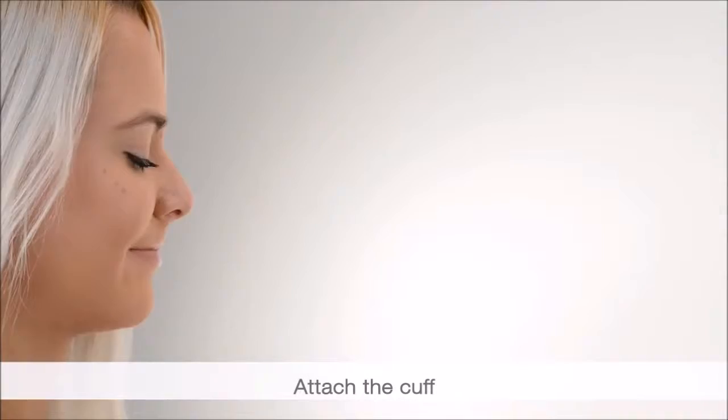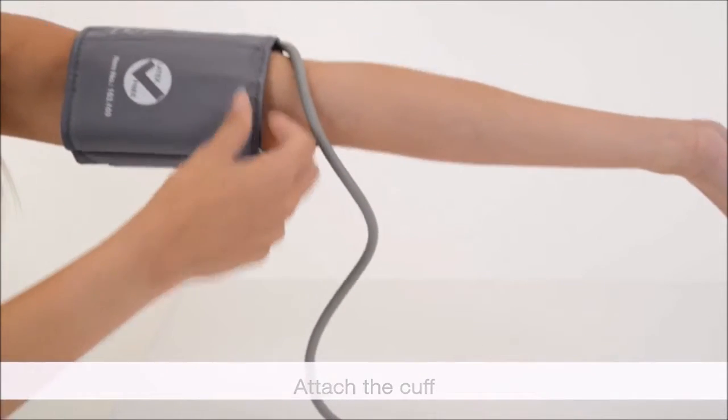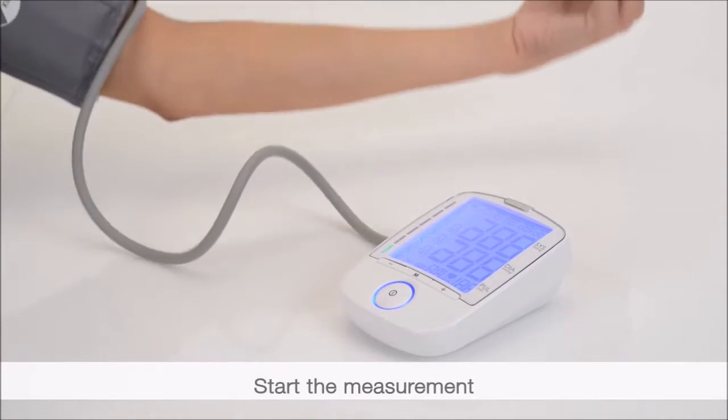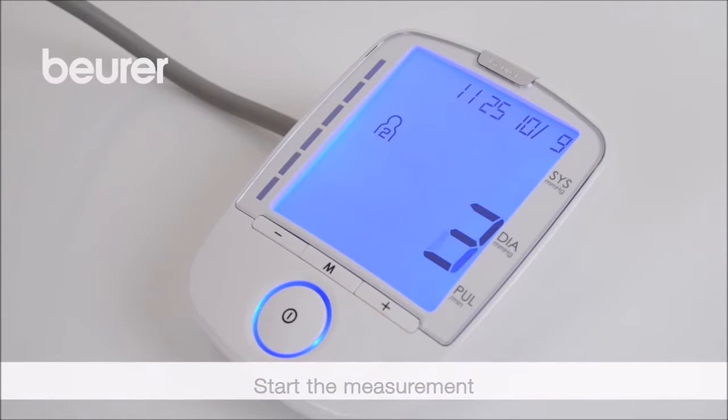The line points to the centre of the palm. It should be possible for two fingers to fit under the cuff. Press start/stop. All displays will illuminate briefly. The last measured value is displayed. The measurement begins.